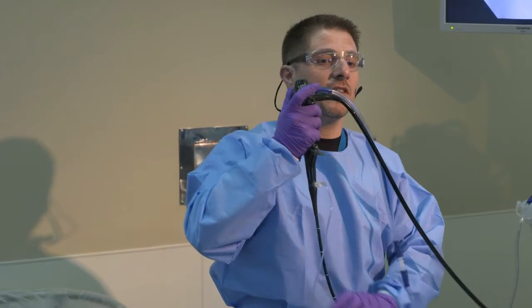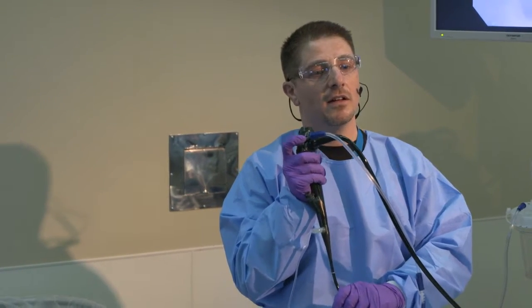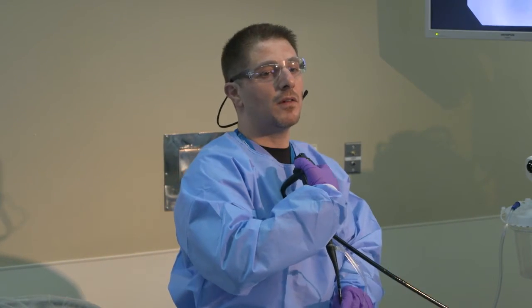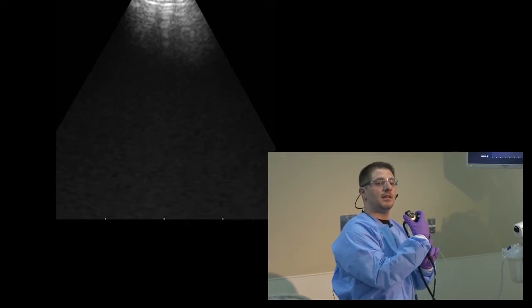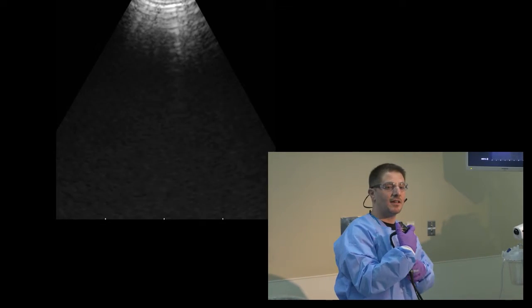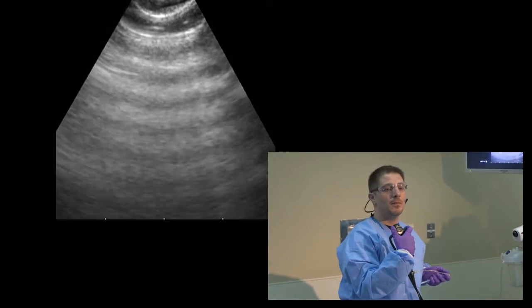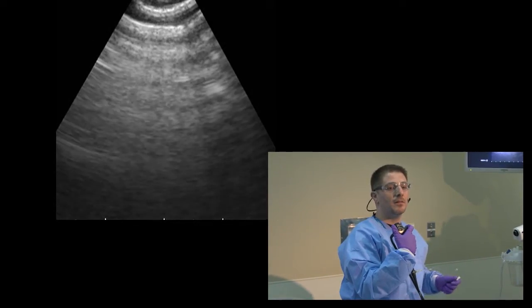So the staging of the mediastinum should start from the contralateral side, starting from the lymph nodes in the left hilar, then going toward the right side. Now we are in the left main stem. You can see in front of us there the left upper lobe and the left lower lobe.